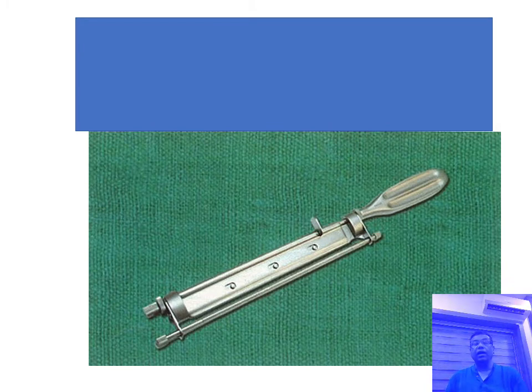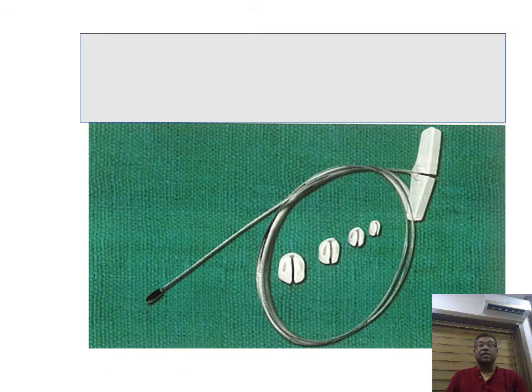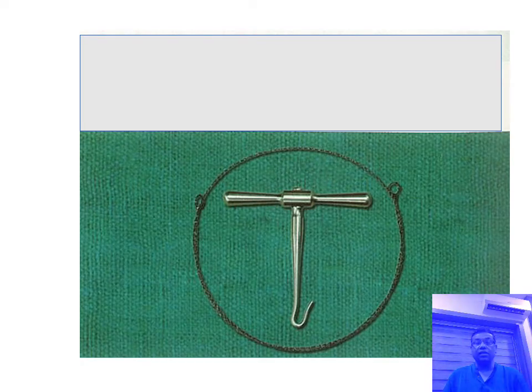This is a Humby knife, used for taking superficial skin grafts. This instrument is called the Humby knife. This is a Mayo stripper, used for varicose vein surgery for patients with perforator incompetence after sapheno-femoral ligation. This is a Gigli saw, used for bony divisions — it has two hooks on either end that can be held and used to cut bones, including long bones, mandible, or maxilla when performing maxillectomy or mandiblectomy procedures.